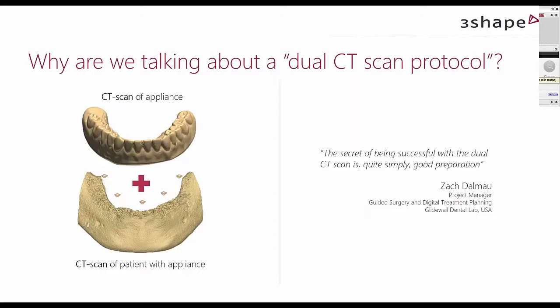That all yields a high likelihood of a good quality scan of the denture or the appliance. And then afterwards we also looked into some details on actually scanning the appliance and the patient and why it's important to consider certain aspects there. So that's kind of what we covered in the previous episode.